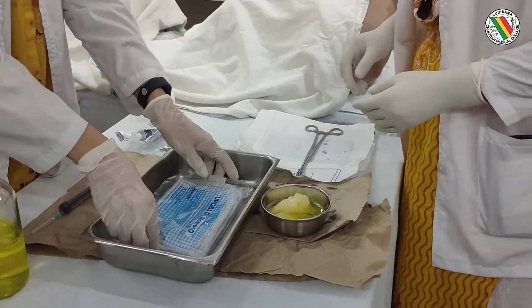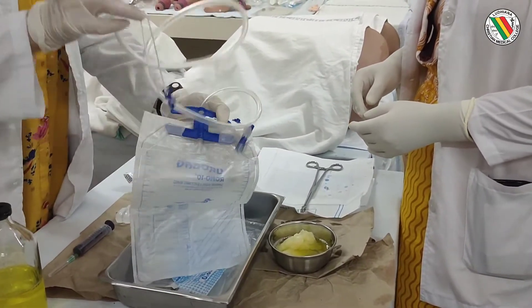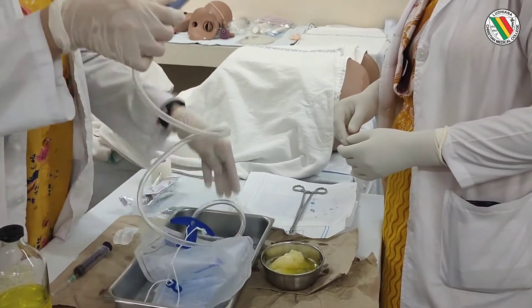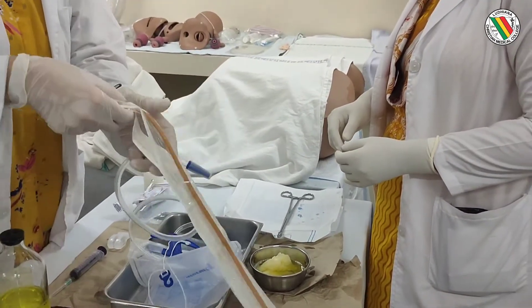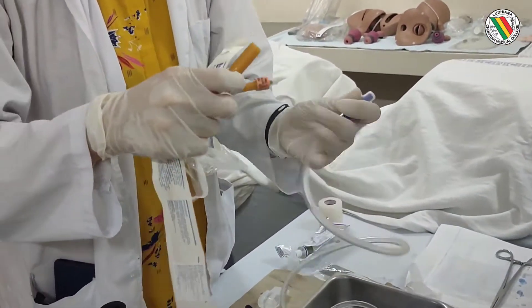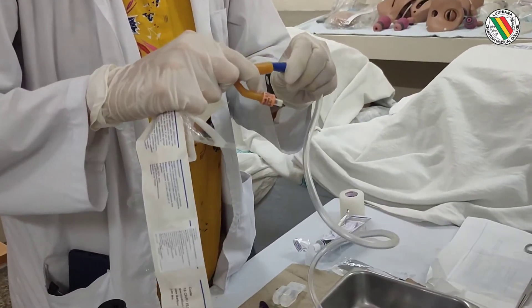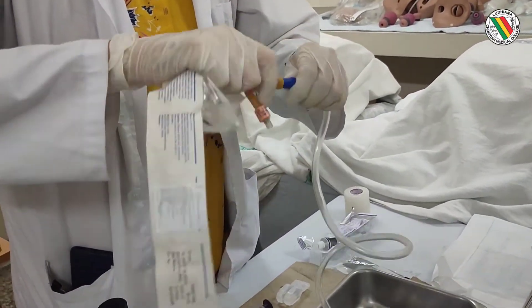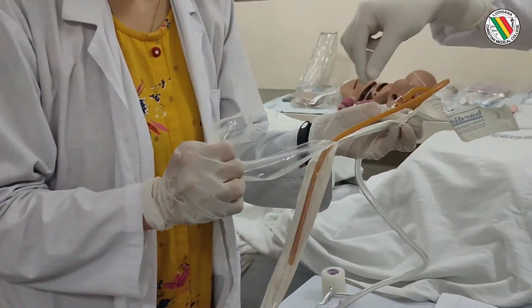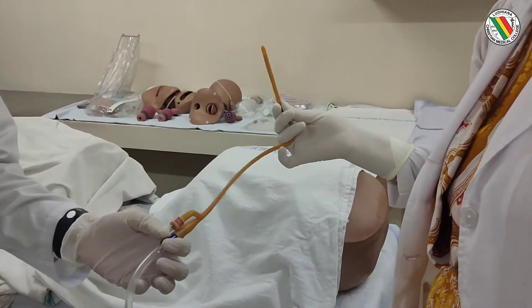Next we take the urobag which is attached to the Foley's catheter. There are two ports: one is for inflation of the bulb and the other port allows drainage of the urine. The urobag is connected to the Foley's catheter, and keeping everything sterile and aseptic, we take the catheter in the right hand.